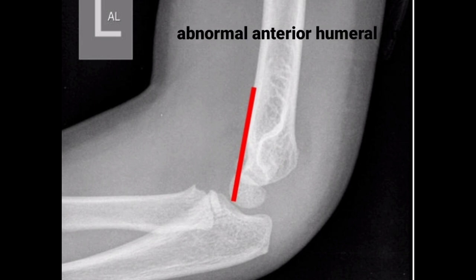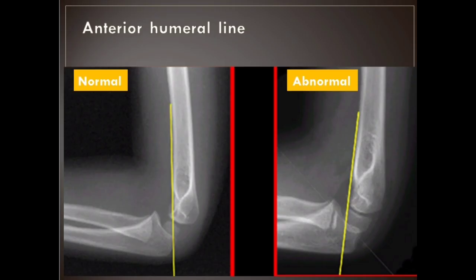Also note the posterior fat pad and sail sign. If there is displacement, it suggests a probable fracture. If the view is not a true lateral, then this line isn't accurate.